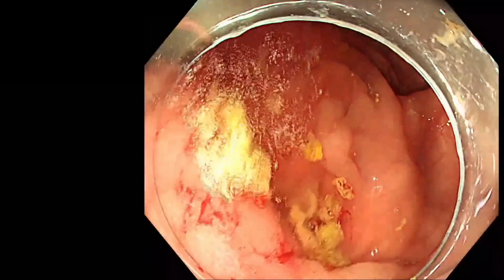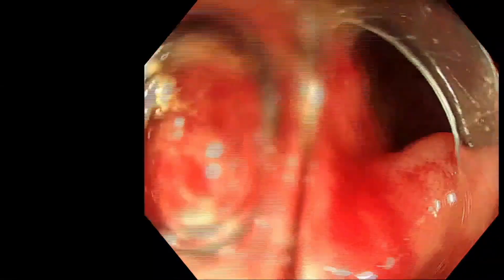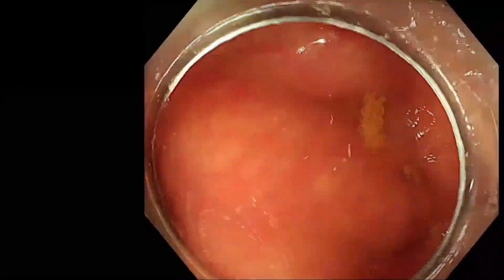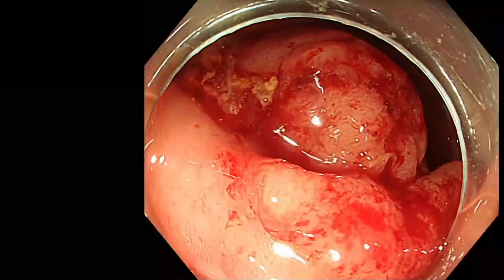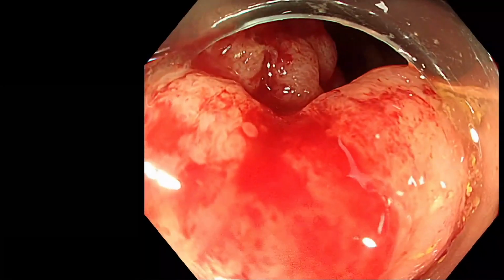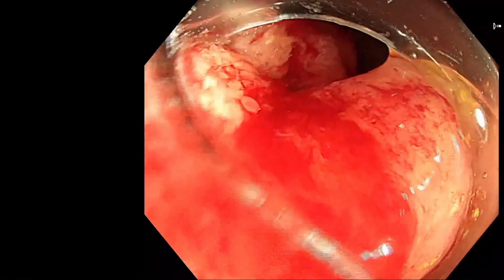And the second thing you want to know is how much of the ileum it involves. Because why are these two things important? Because they determine the chance that you're going to be successful at this. I mean, obviously you need to be able to do polypectomy. It's a whole other topic, but even if you can and you're an expert, the fact that this involves multiple or full circumference of the valve will make it less likely that you succeed.